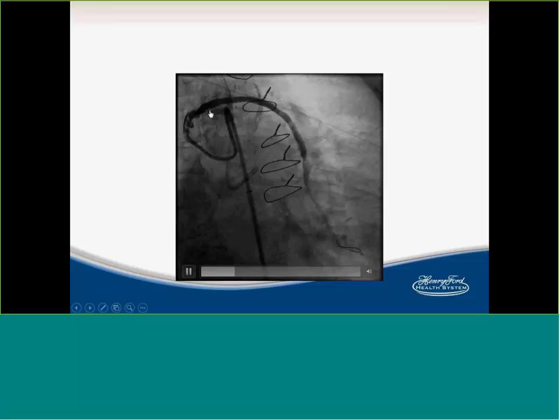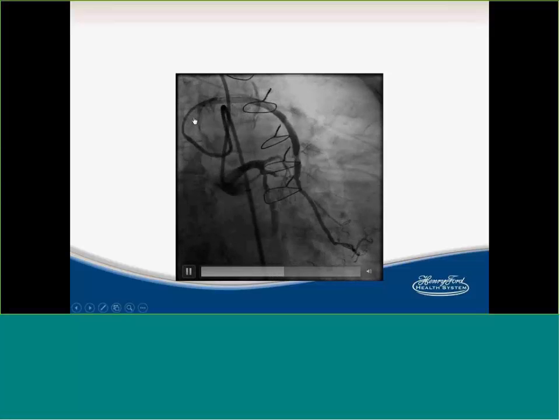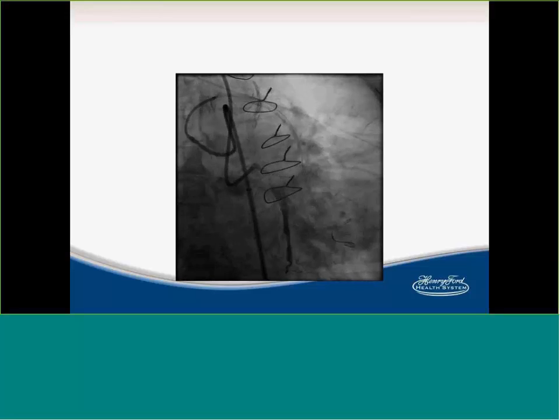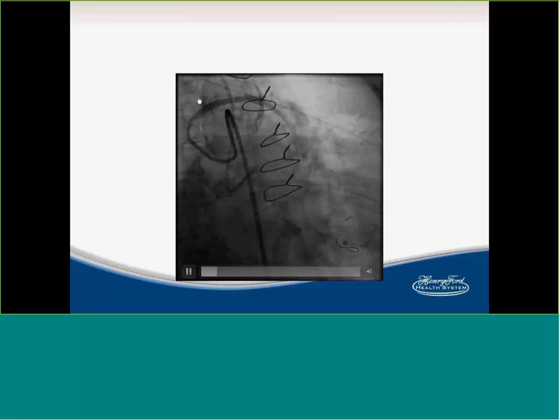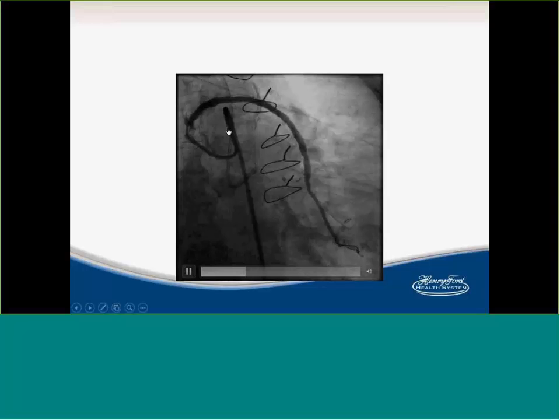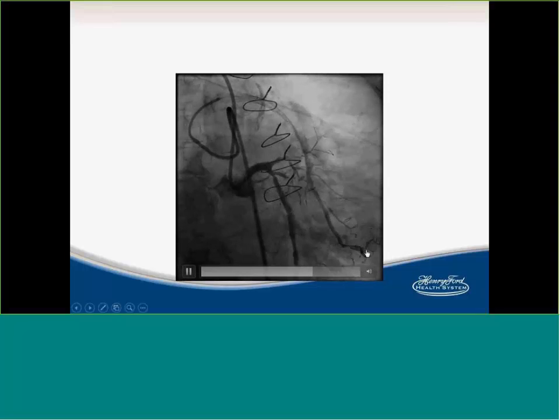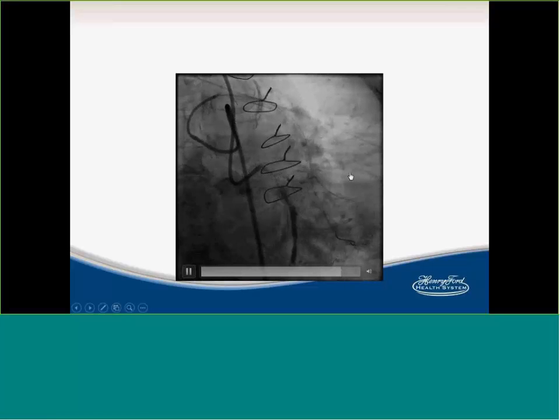And sometimes I think if you have the graft stent all the way out in the ostium, then it might be very hard to engage them because the stent kind of acts against you. Exactly. So we basically put a wire, and this is a GuideLiner, push it in here, and this is dual injection. And this segment, this is the OM, that's where the graft goes.